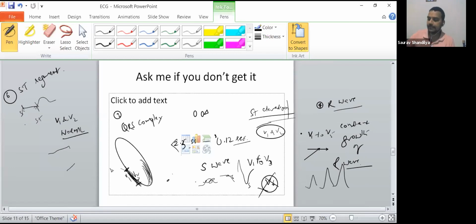Okay, now T wave. Okay, fine. Before that, somebody asked me about the R wave. What do you want to know about the R wave? This was Q, this is R, and this was S. So what do you want to know about the R? I was saying you should see R, for a physio, just to see that. I mean, for everybody, but I'm just talking about physio because I'm teaching physios.